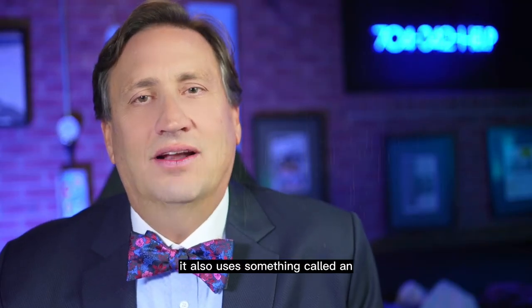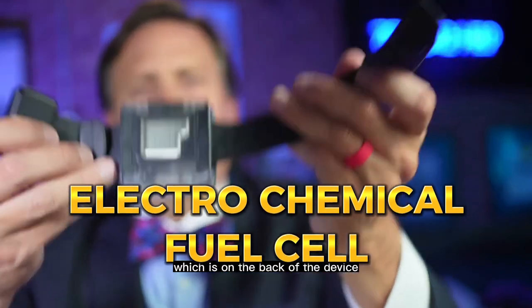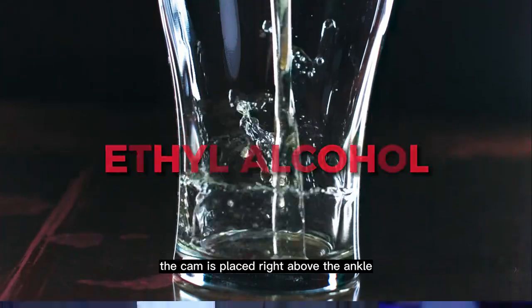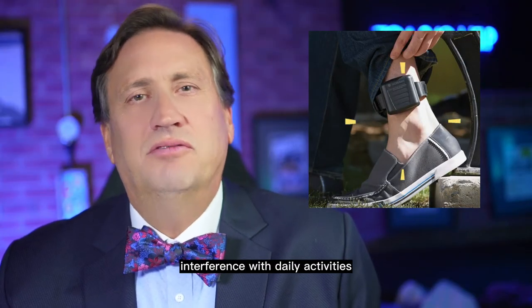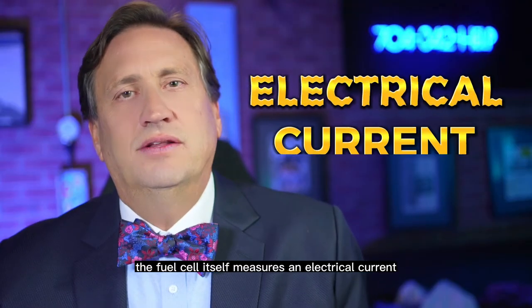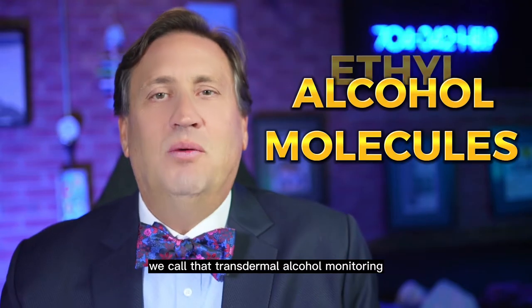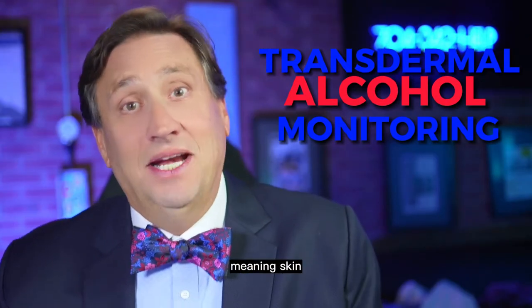It also uses something called an electrochemical fuel cell, which is on the back of the device, to measure for the presence of alcohol — ethanol, also known as ethyl alcohol. The CAM is placed right above the ankle because it seems to pose, at least potentially, the least interference with daily activities. The fuel cell measures an electrical current created by the number of ethanol molecules produced from a person's sweat glands. We call that transdermal alcohol monitoring — trans meaning across, and dermal meaning skin.